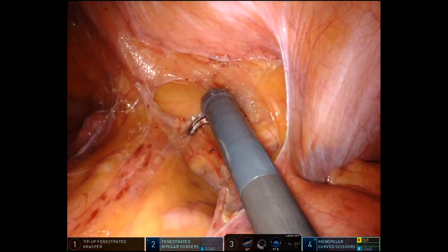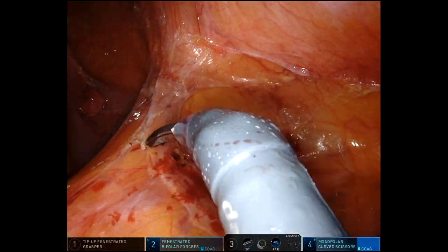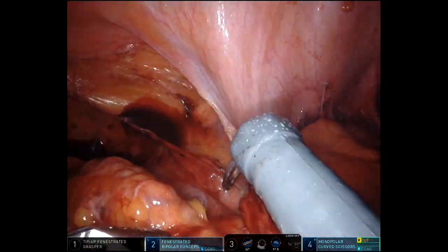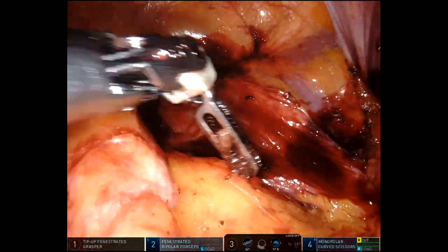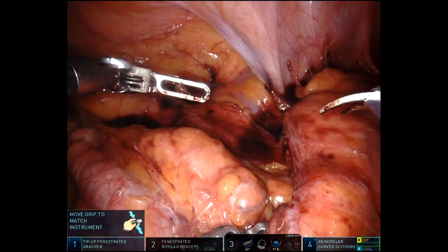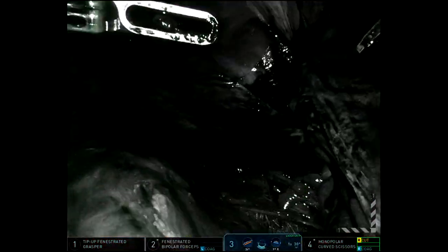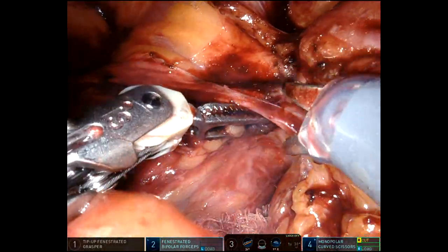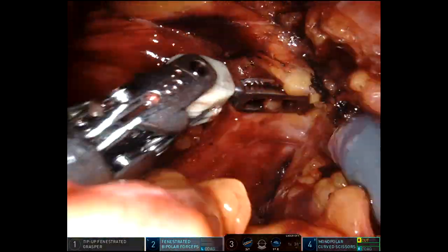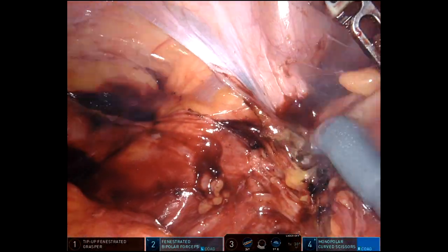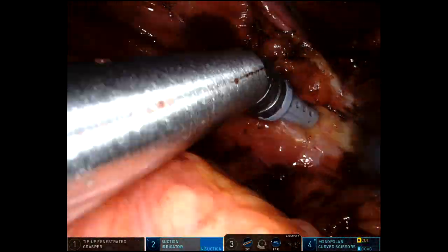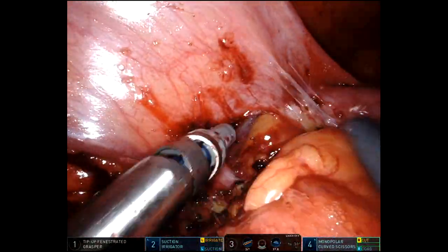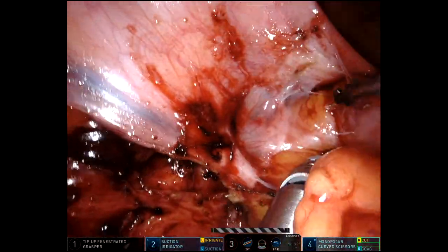Not shown in this video was that I did a full lateral dissection including mobilization of the splenic flexure in order to gain length for the anastomosis, as this anastomosis was much lower than a standard sigmoid. Here I'm joining the previous medial dissection — you can see the sponge — and trying to dissect down towards the left pelvic brim where it's really stuck. This proved really challenging due to the chronic inflammation.